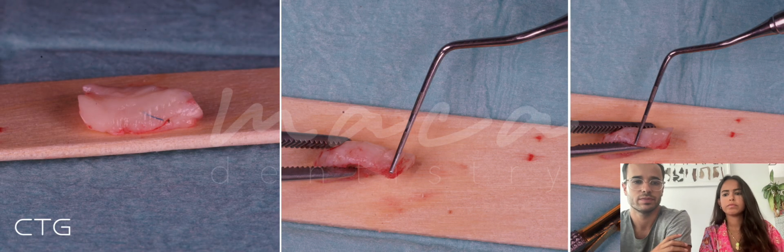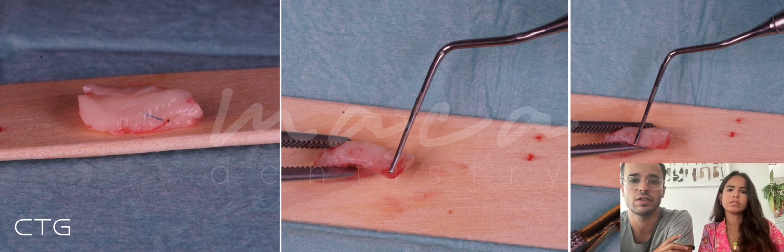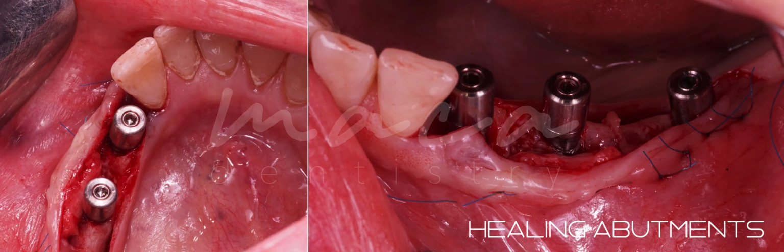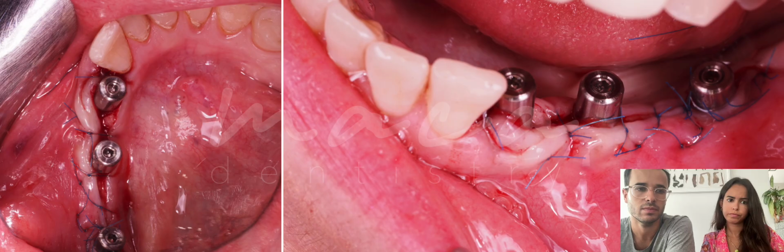So to achieve that thickness, we grafted a connective tissue graft from the palate, and in these pictures you can see how thick the graft is that you can get from the tuberosity, and this way I could cover a very extensive area with only one graft. We did a split thickness flap, we placed OMNI abutments and then the connective tissue graft around the implants, and here with the connective tissue graft suture and the healing caps in place. Then we suture the flap and wait for the healing.